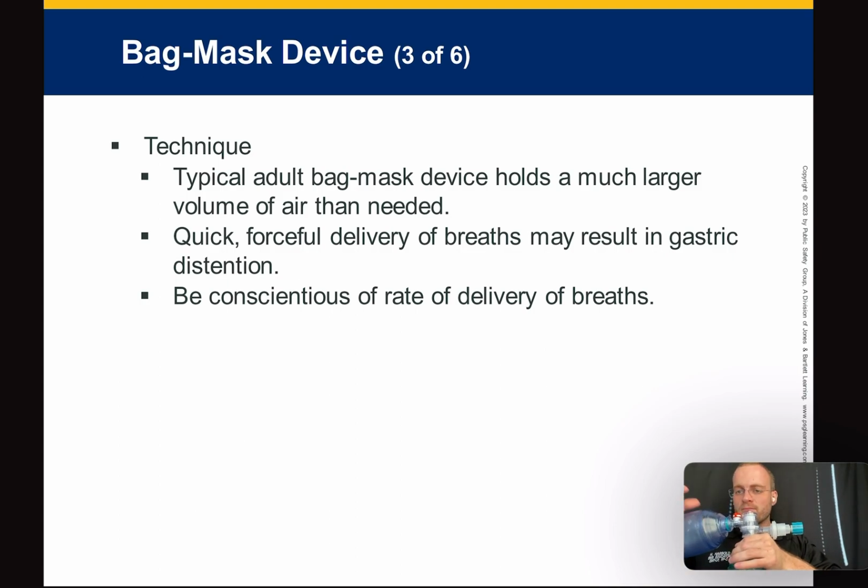Good point. The second bullet point here, this one. If you go like this, and I've seen this, right? People get under stress and they do weird stuff. So they go like this, 1, 2, 3, 4, 5. You're going to force air down the esophagus and not the trachea. And so what happens when we put air in the esophagus, also known as the food tube that's behind the trachea? They vomit. Okay? So be careful of that.